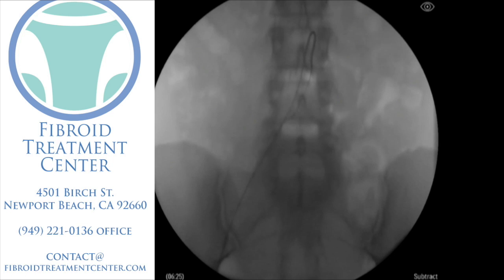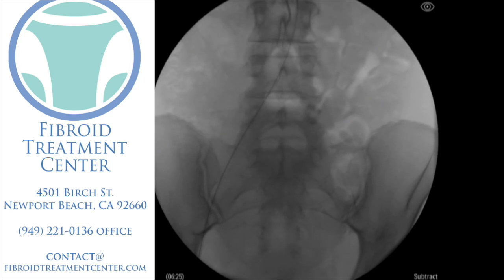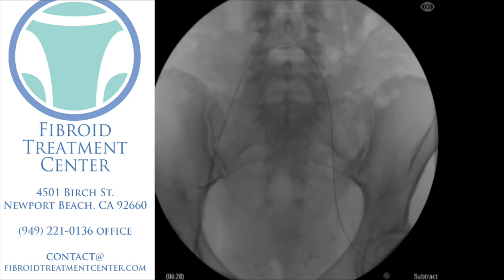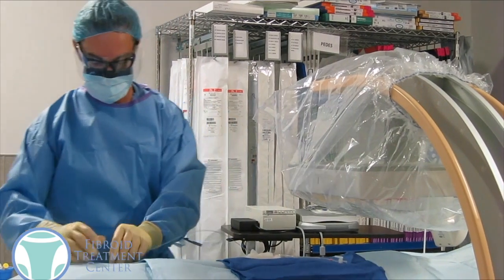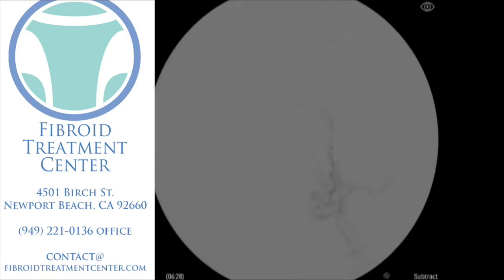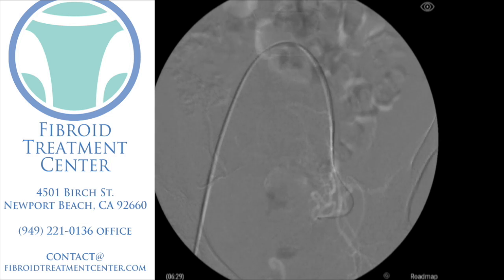We're going to put that catheter and that wire into the artery, and as you can see here on the screen, we're going to advance the catheter and the wire. Starting off, we go into the right artery, which is actually on the left side of your screen, and we go up and over from the patient's right side to the patient's left side. We're going to advance that wire down into the area where we think the uterine artery and the fibroid arteries are going to be. We then advance a different shaped catheter up and over from the right to the left side, remove that wire, and take x-rays of the pelvis to see exactly where the artery is that is feeding the fibroids on the patient's left side.